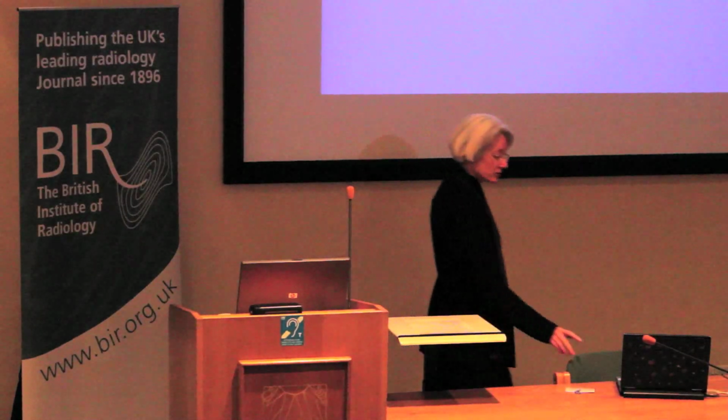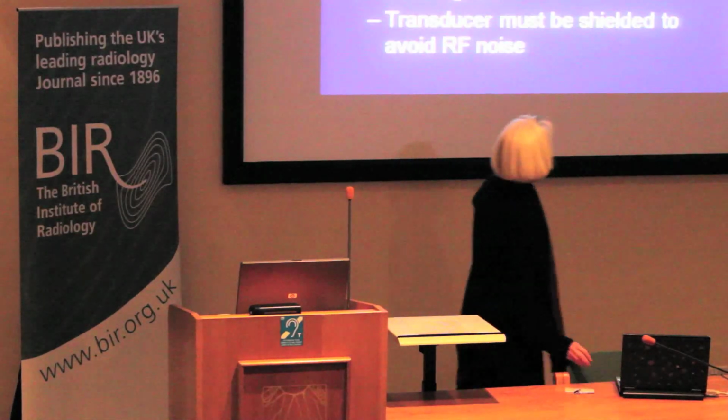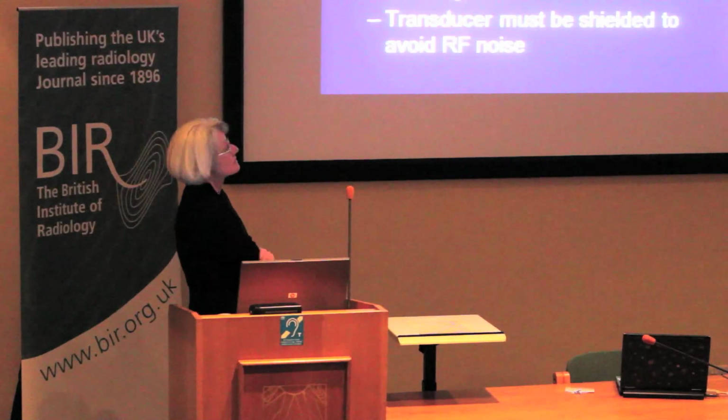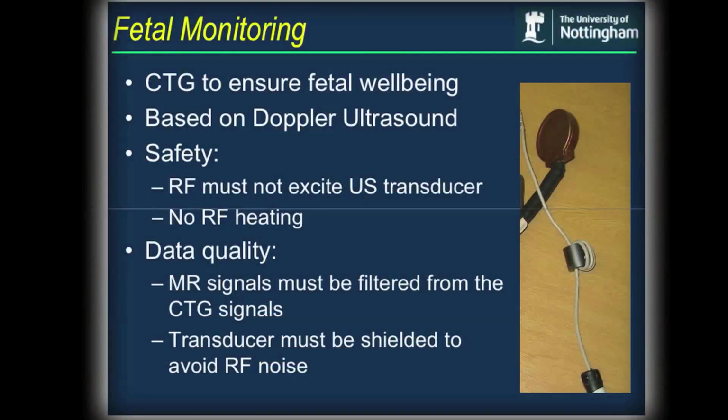You can do fetal monitoring to check the heart rate during the scanning, if the baby is already sick. We've used the CTG system that was made to be MR compatible. We did require changes to the design of it to make it safe to use in an MR environment, so that it didn't pick up the RF power to induce heating in the mother, and also to make the Doppler ultrasound signals detectable.